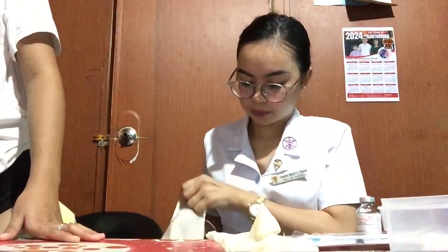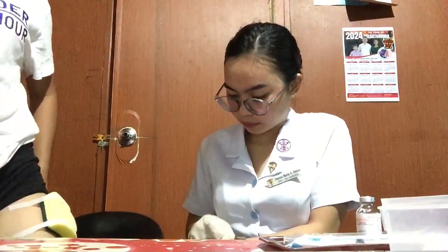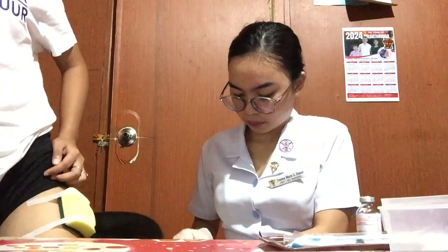So I have here a working glove. Now I'm going to wear it. Clean the site with an antiseptic swab using a circular motion. Start at the center and move outward about 5 centimeters.